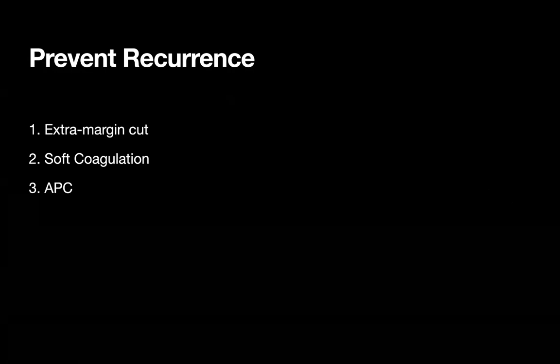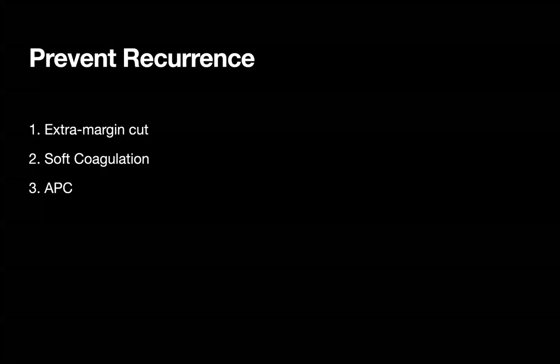Sriram, any comments? I agree with Sylvia. I would like to check if I got the margin or not with NBI, and if I have any suspicion, then I use soft coag for the margins. I definitely agree. Yes, only in case of suspicion.